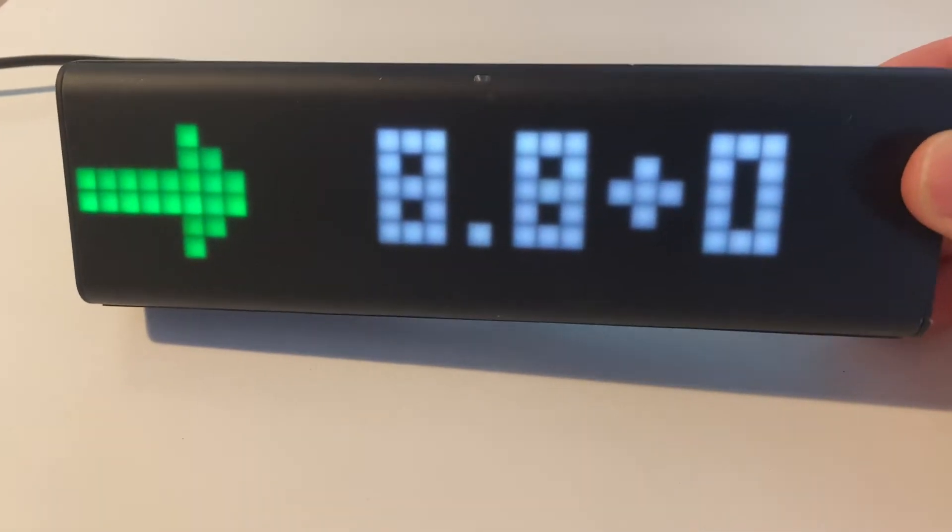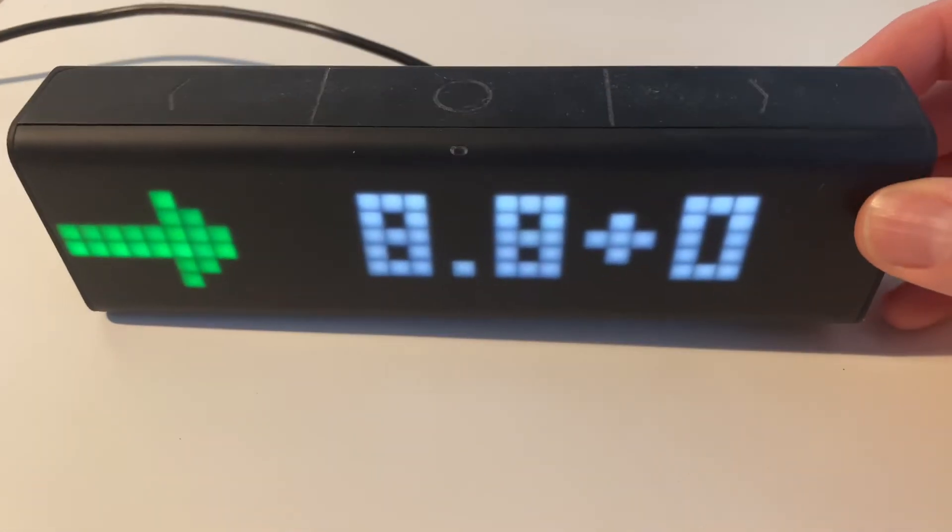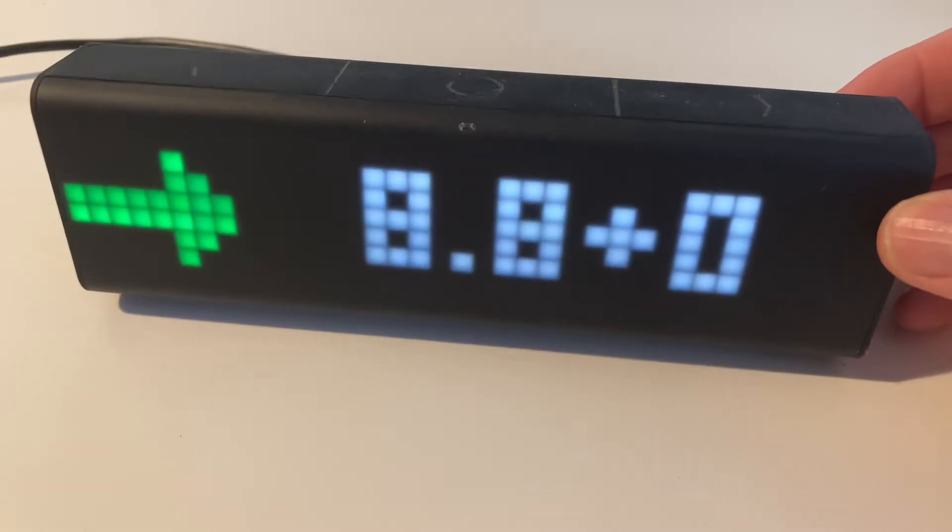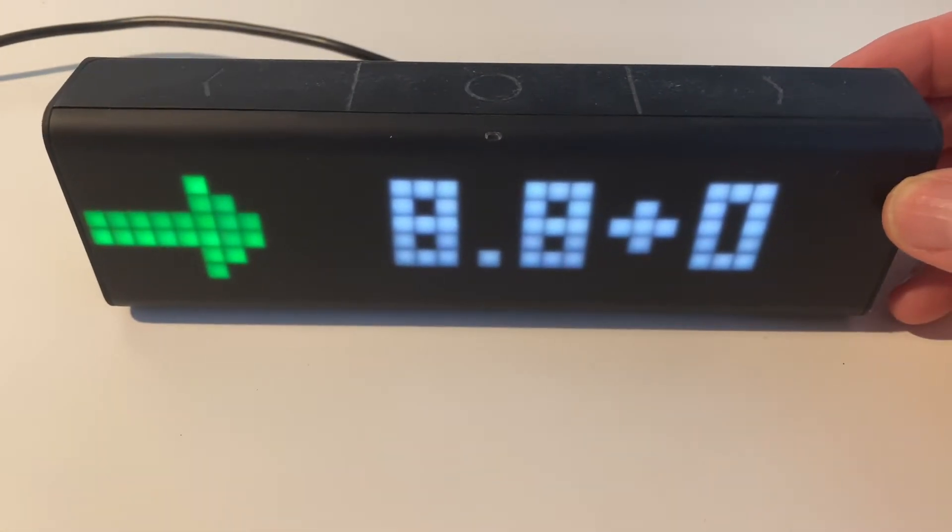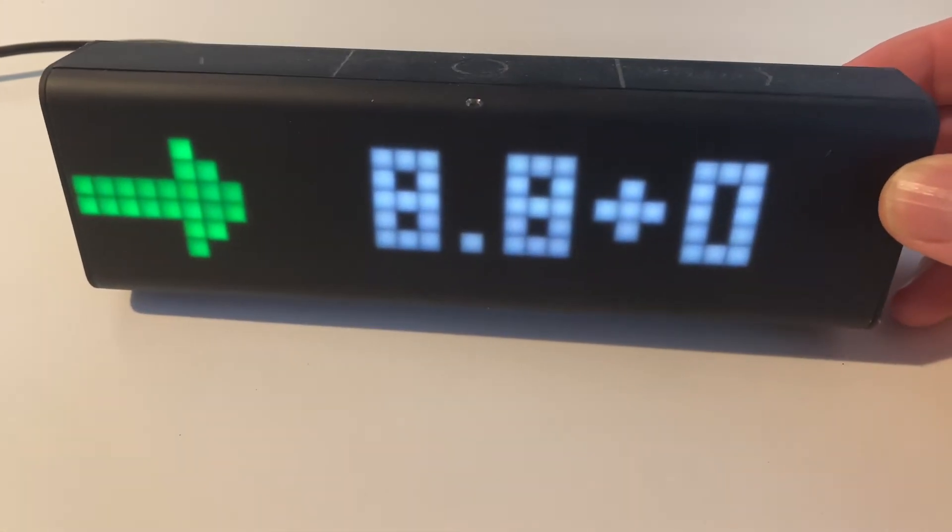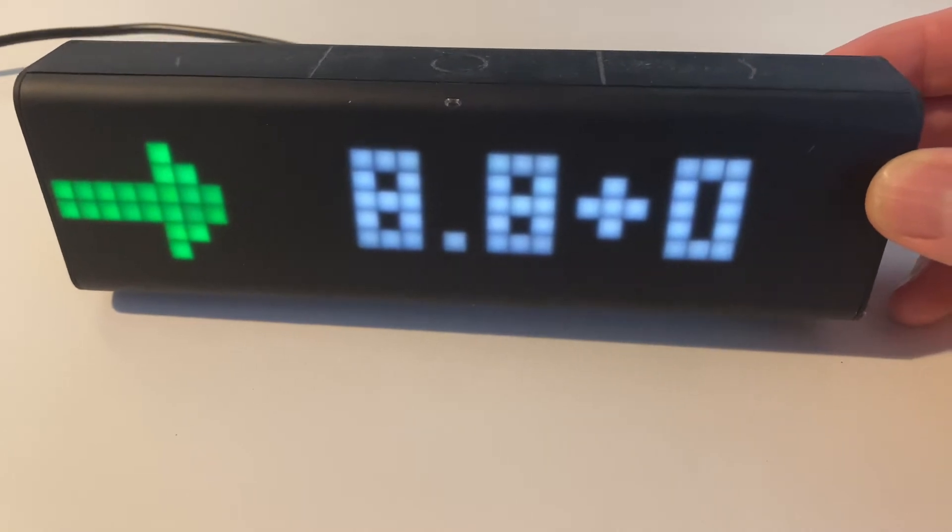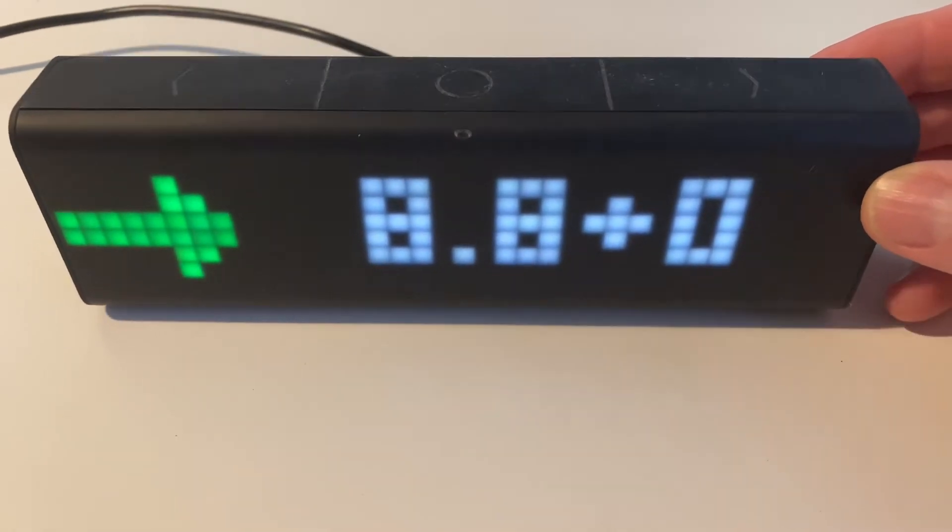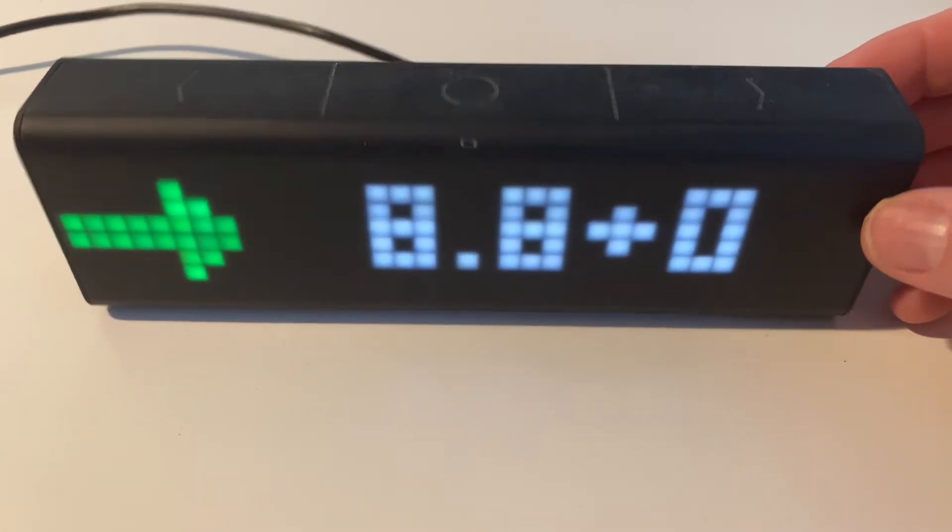This is basically a device that you can configure to talk to Nightscout via an app that you can install, and it displays constantly your latest blood sugar readings from your Nightscout website.